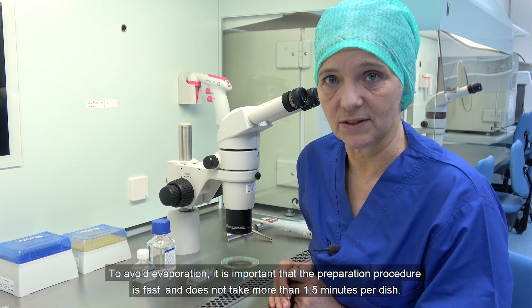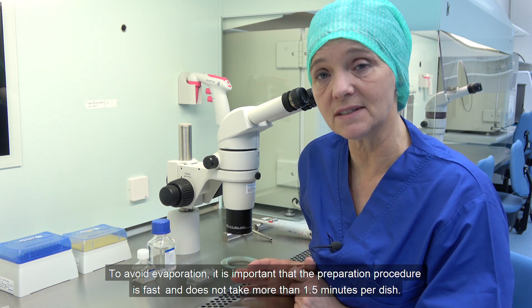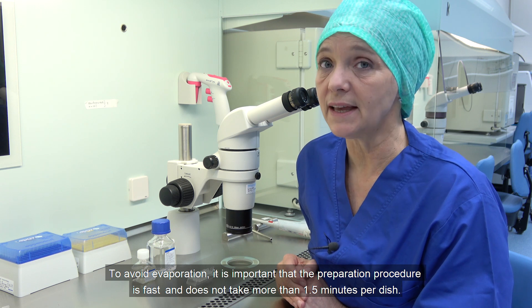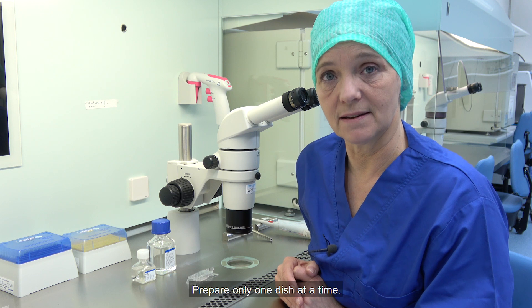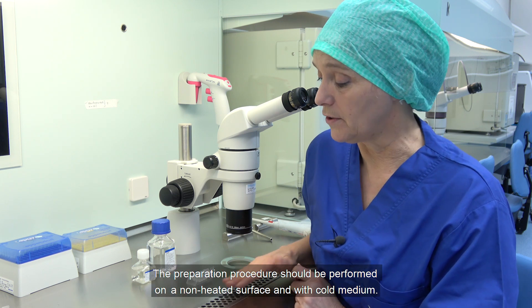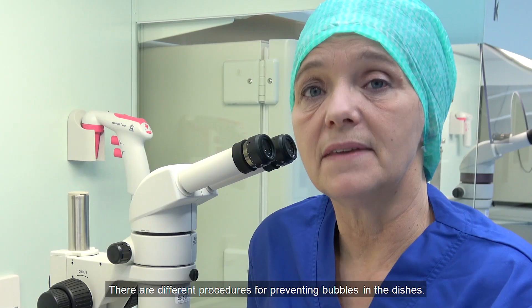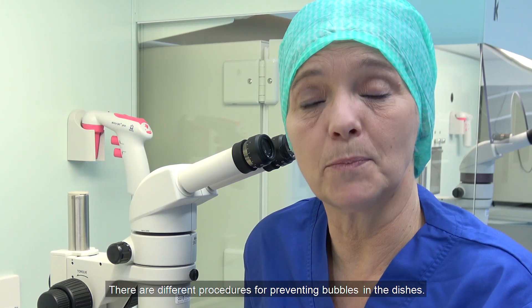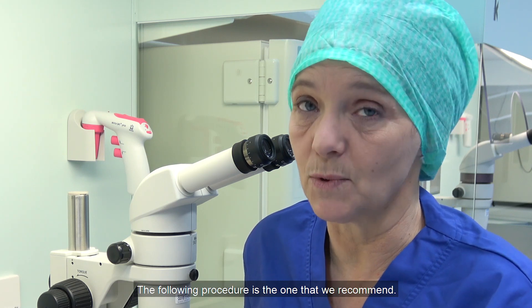To avoid evaporation, it is important that the preparation procedure is fast and does not take more than one and a half minutes per dish. Prepare only one dish at a time. The preparation procedure should be performed on a non-heated surface and with cold medium. There are different procedures for preventing bubbles in the dishes; the following procedure is the one that we recommend.